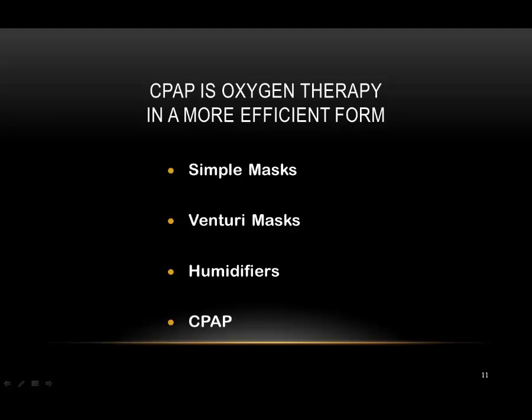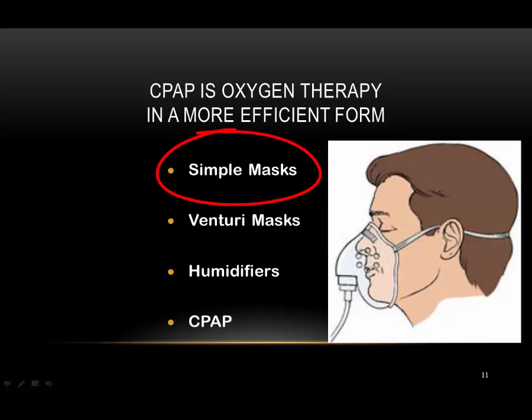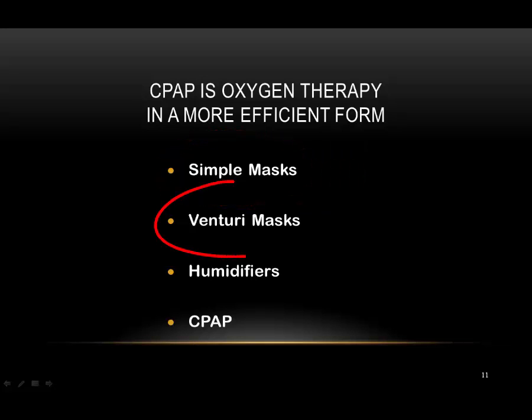Don't use CPAP on every patient that needs supplemental oxygen. Use nasal cannulas or masks on them as we have always done. CPAP is indicated for people who are sick. The patient may not need to be in the stabilization room, but they should have serious respiratory difficulty to need the use of CPAP. Medium concentration oxygen masks are unable to deliver an accurate oxygen percentage since the patient inspiratory flow is not taken into account.